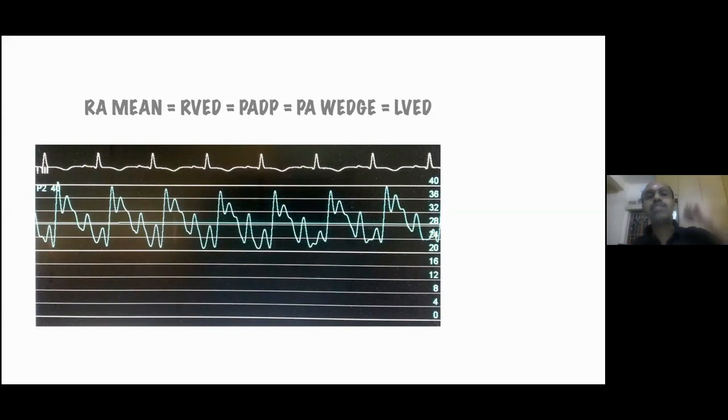So flow is maintained. Higher right ventricular flow is maintained during inspiration. Right atrial pressure drop is not happening. Kussmaul sign is failure of right atrial pressure drop. Increased flow in inspiration is maintained. That is the reason tricuspid valve flow Doppler is exaggerated in inspiration. It is at the cost of exaggerated ventricular interdependence hitting the mitral valve, so mitral valve flow will proportionately go low.